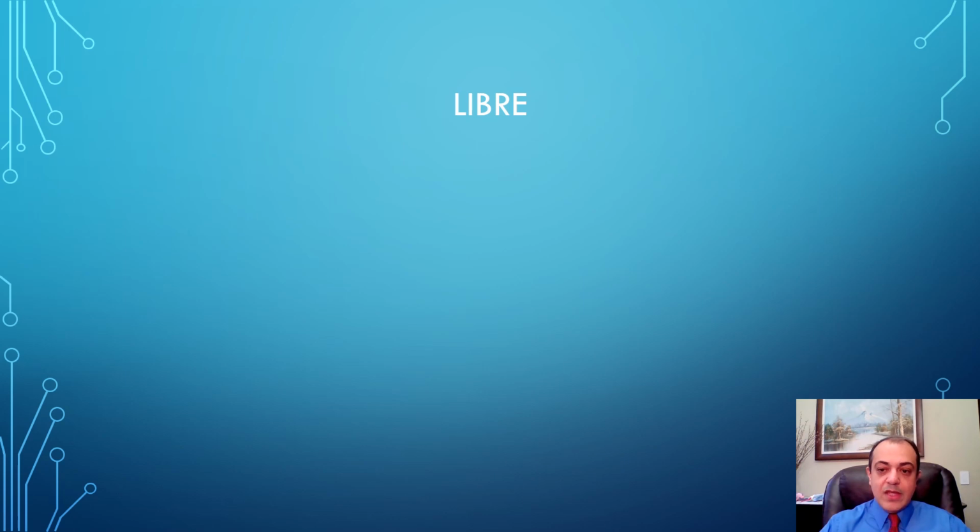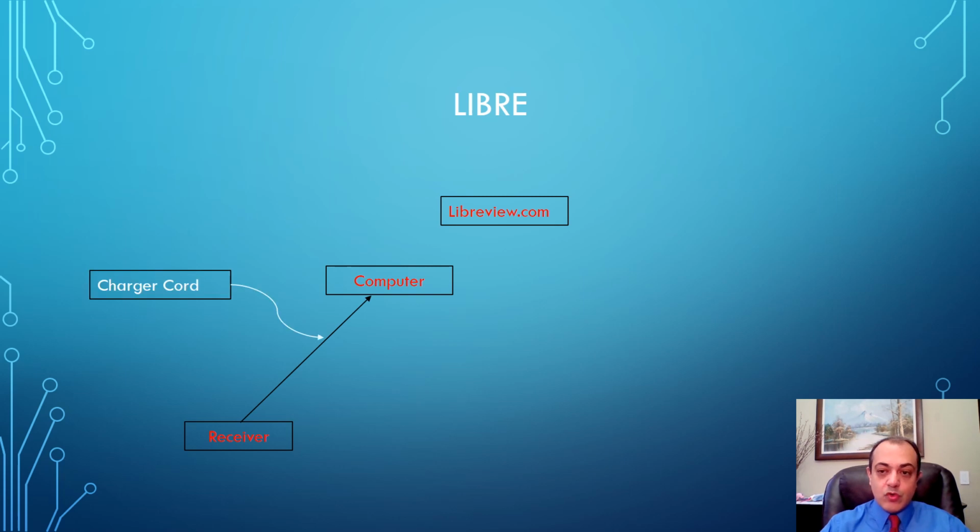So for the Libre, the connection goes in this way. And again, it follows the same principles that we talked about in the beginning. First, there is the cloud storage, and the connection to it is from the libreview.com site. Then you have the receiver, which is the black box that you can upload onto the computer using the charger cord.